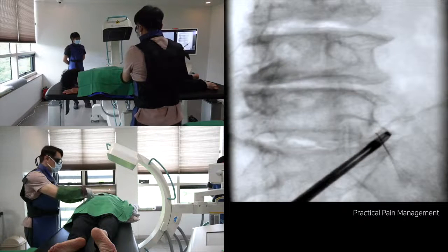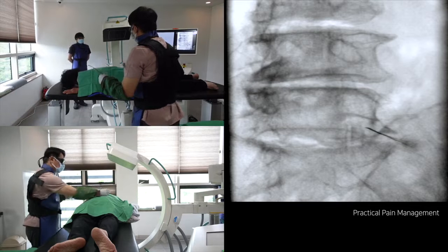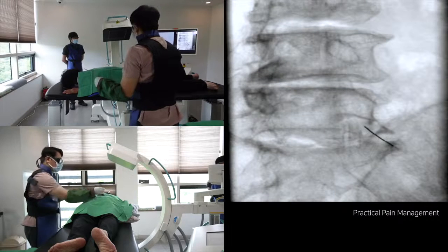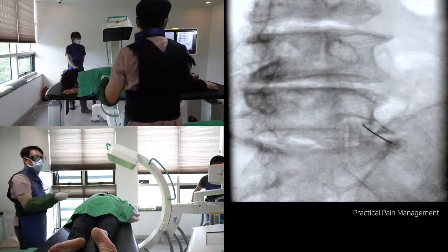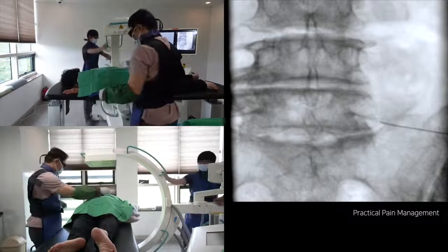I don't have much choice in the needle entry point because of the high iliac crest and downward deformity of the transverse process. I will just put the needle in the center of the triangle and advance toward the center. If I direct the needle to the pedicle too close at the 6 o'clock position, I may hit the bones. Let me show you an AP view.